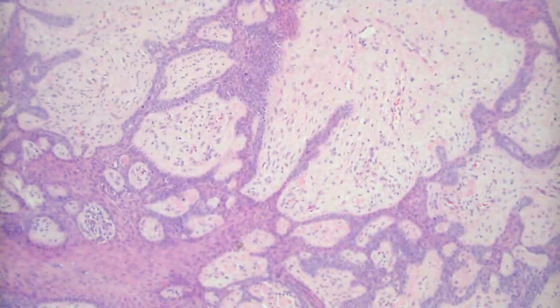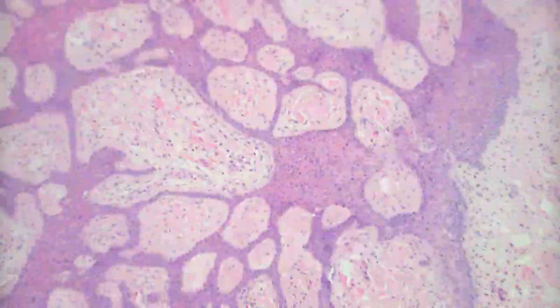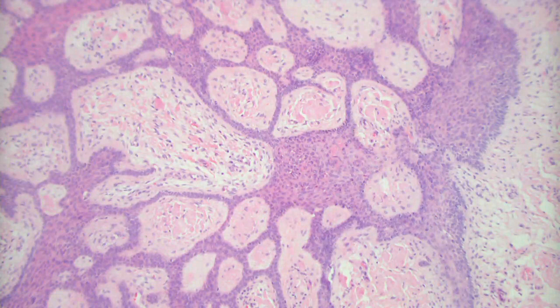If it's got this kind of fibromatous stroma, it's going to be much harder to wipe out these aggregations down here. So if the guy actually did have a little basal cell carcinoma and you wanted to treat this, it's far better when you get this fibromatous component to do an excision of it. So these are best treated with surgical excision rather than destruction, if you're going to treat them at all. And most people do treat them.